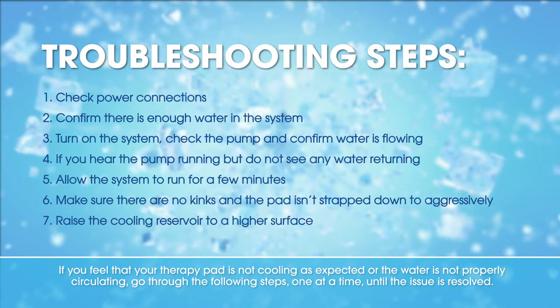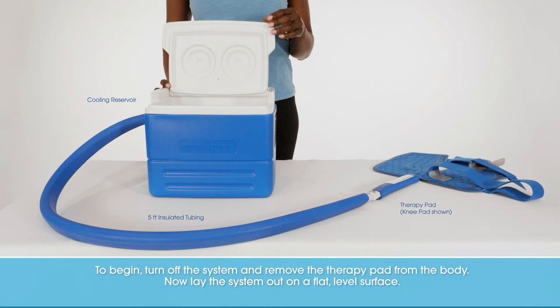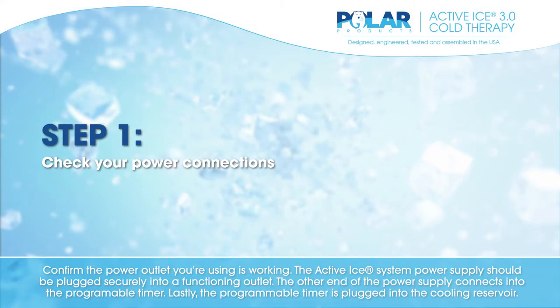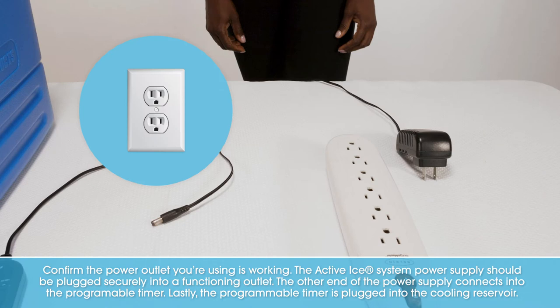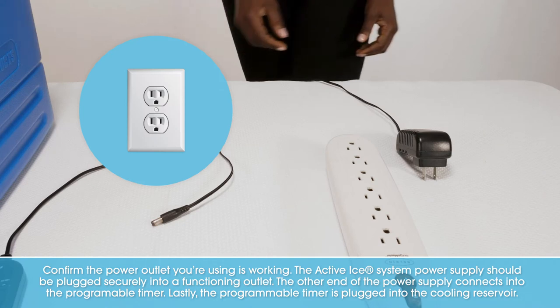To begin, turn off the system and remove the therapy pad from the body. Lay the system out on a flat, level surface. Confirm the power outlet you're using is working. The Active Ice system power supply should be plugged securely into a functioning outlet.